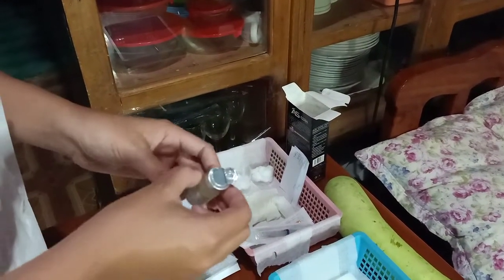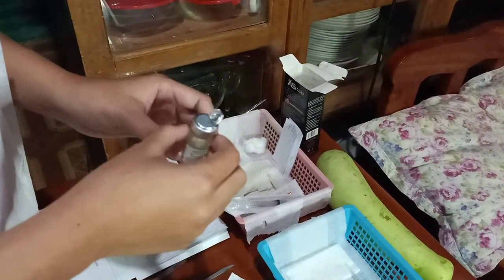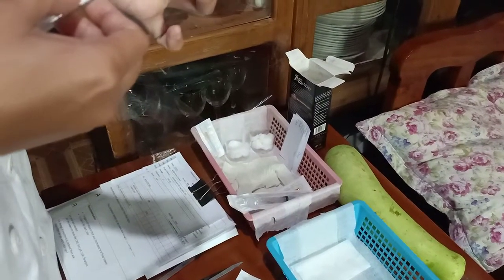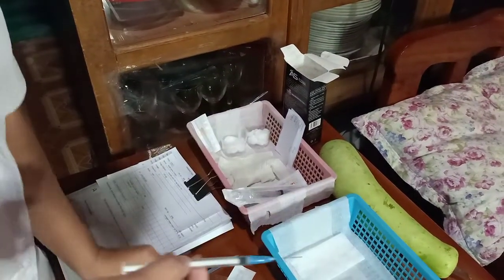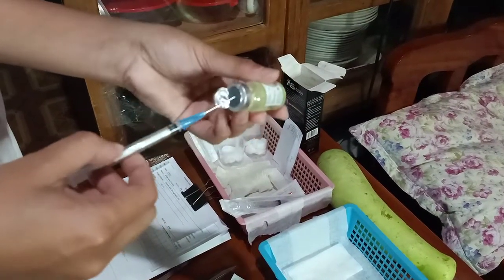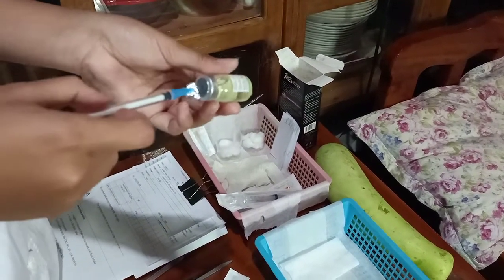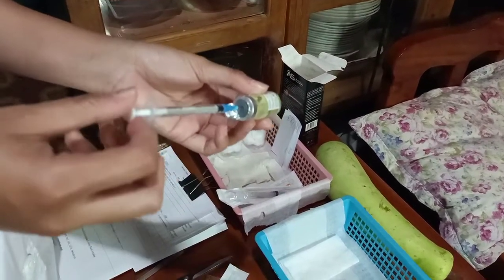Take the syringe, draw some air into the syringe, and inject the air into the vial. Invert the vial and draw the exact amount of medication needed.